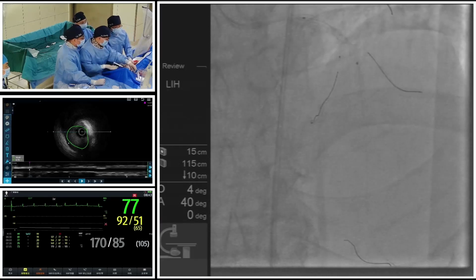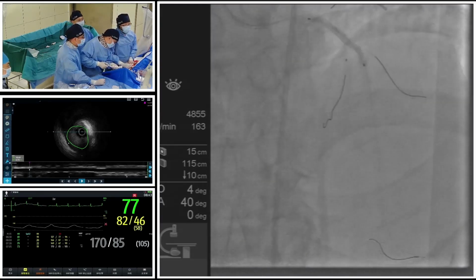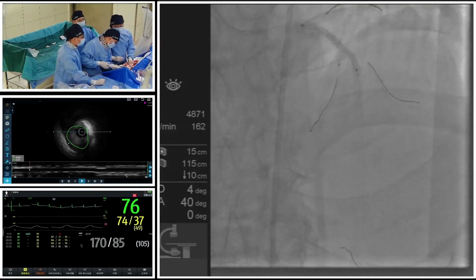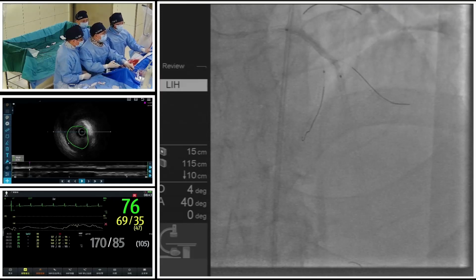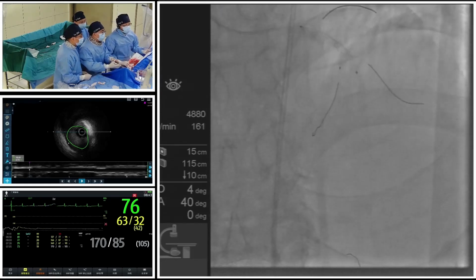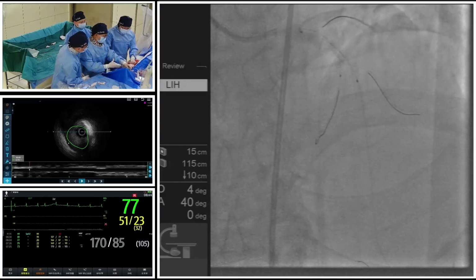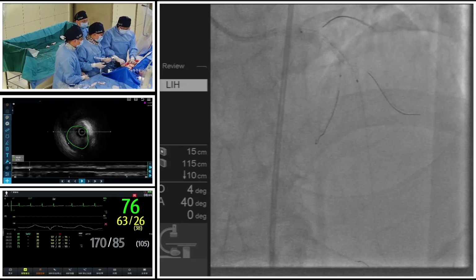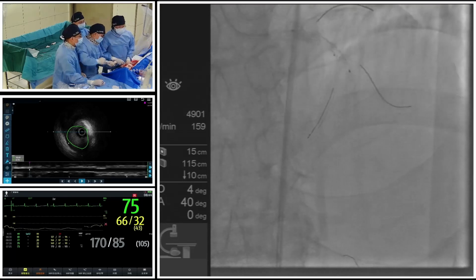Professor Lee has just released the first stent and covered the ostium of the septal and the diagonal at the same time. I think this is a good choice because if we are only covering one of the side branches, it is relatively difficult to keep the opening of the other ones. Okay. So I think the side branch balloon should be inflated again. Maybe. So really, there are many types of jailed balloon technique, but I prefer to use this one. Okay, inflate. Yes.